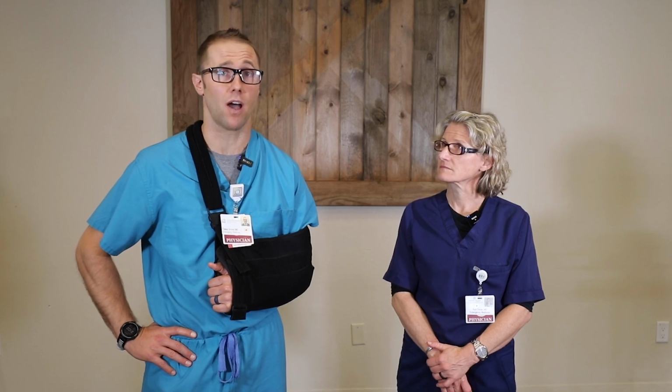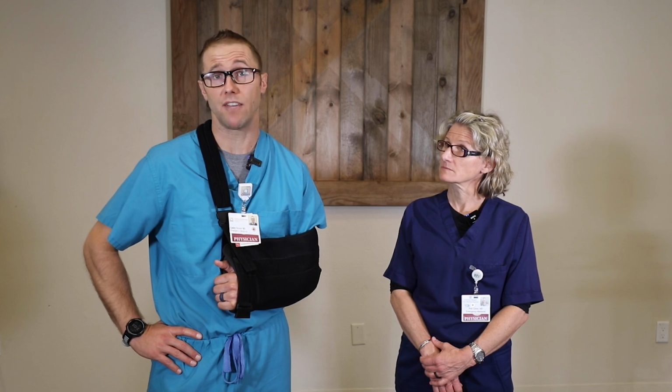If you're wondering when you might need to give a dose of the nasal naloxone, it would be when you suspect a person has had an opiate overdose. What that can look like is that a person would be unresponsive, they might have shallow breathing, or not even be breathing at all. You'd want to give a dose of this medication, as Dr. Close demonstrated, if you suspect that a person could be having an overdose, such as a person who is unresponsive or poorly breathing. And as we saw from me receiving multiple doses, if you're wrong, giving a dose to someone will not cause any harm. As long as you call 911 and paramedics are on the way, they'll get the treatment that they need.